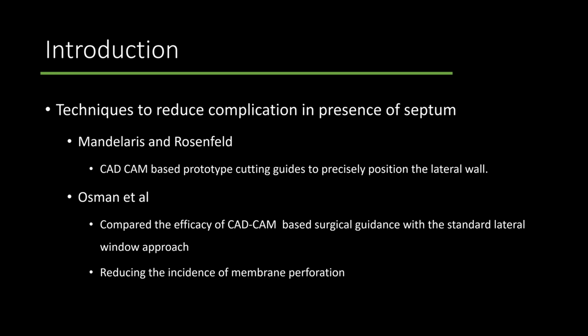Mondelaris and Rosenfeld proposed the use of computer-aided design and computer-aided manufacturing, CAD/CAM, based prototype cutting guides to precisely position the lateral wall. Osman compared the efficacy of CAD/CAM based surgical guidance with the standard lateral window approach technique in terms of reducing the incidence of membrane perforation, demonstrating that computer-guided sinus floor elevation can achieve promising results in accurately modifying lateral window osteotomy and can serve as a safe alternative to the standard technique.